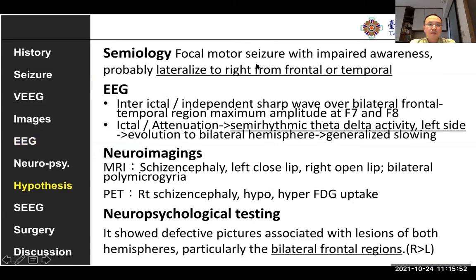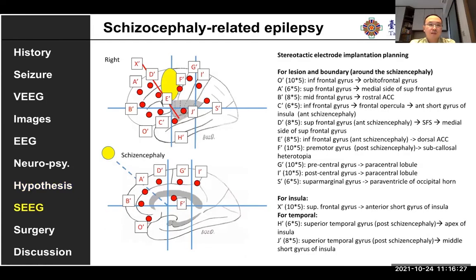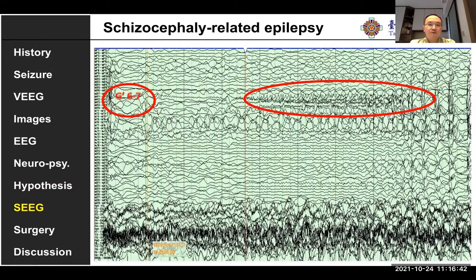Semiology tells us the seizure is coming from the right side, as we can lateralize to the right frontal or temporal region. But EEG is confusing because the ictal activity appears to come from both sides. Neuroimaging shows bilateral schizencephaly with hyper- and hypometabolic areas, and the right side is more severe than the left. So we placed SEEG electrodes on both sides, but more on the right side because we believe the right side is more significant based on semiology.